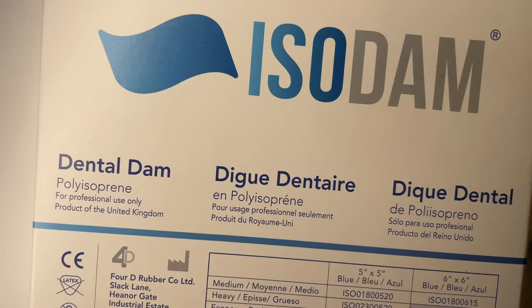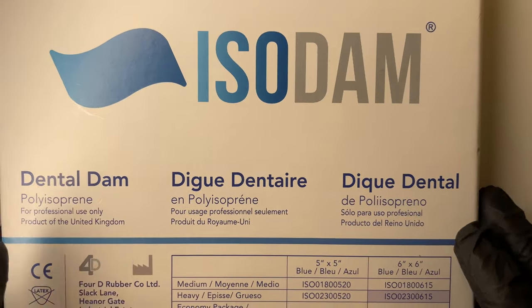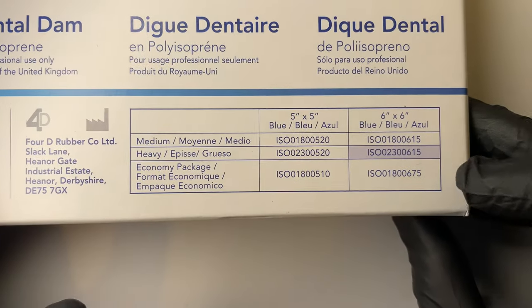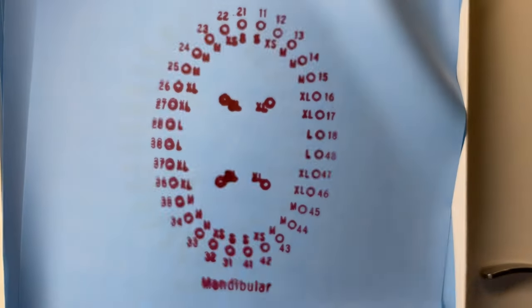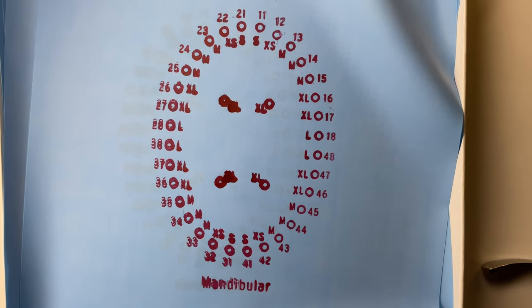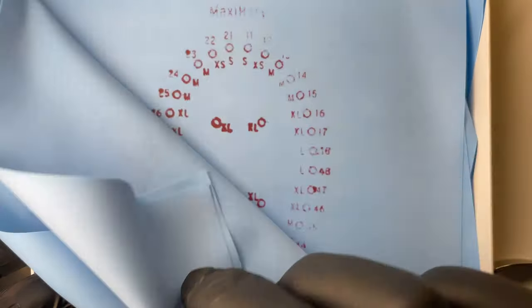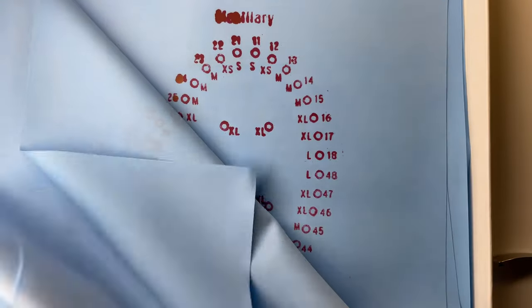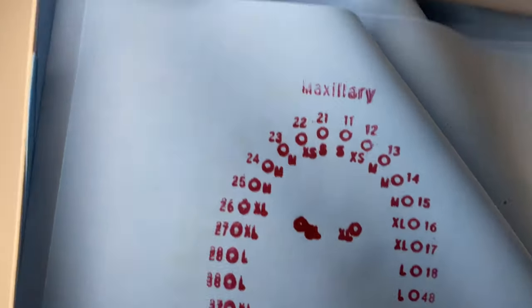I'm going to place the dam now. We're going to be using a product called Isodam, which is the one we sell on the website. I think this is the premium, best latex-free dam available. I like to use the heavy for restorative work as it just inverts a little more, although the medium is also good for endo or single tooth work. As shown in previous videos, you can stamp all the sheets using our rubber dam stamp, which is really helpful for getting the holes in the right place and the right size — you can delegate that to a nurse.